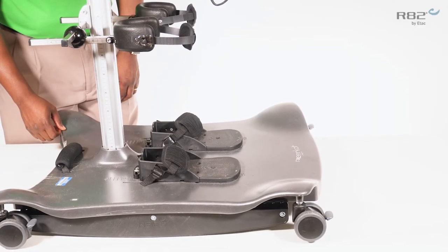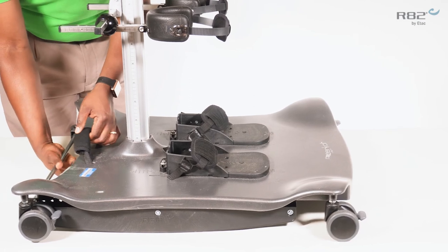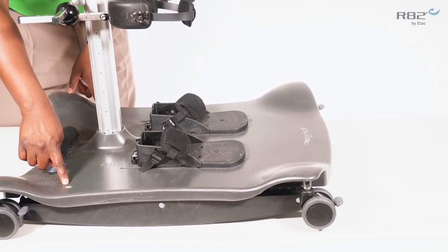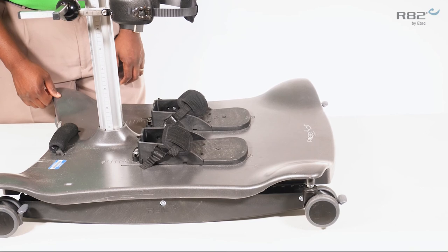The rocker has multiple adjustments for forward and aft adjustments. A window is located at the rear of the base plate, and these windows will allow you to see the position of the rocker.